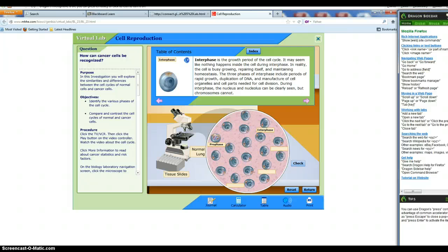Good luck. Have fun. This is one of the most meaningful labs we have in the virtual biology class. It's the way pathologists do their work. It simulates it, but you can see that it isn't as easy as just grabbing a biopsy. You have to know which tissue it's from, for sure, and you need to compare it with healthy tissue to determine if there's really a cancer. And you probably should use multiple samples.